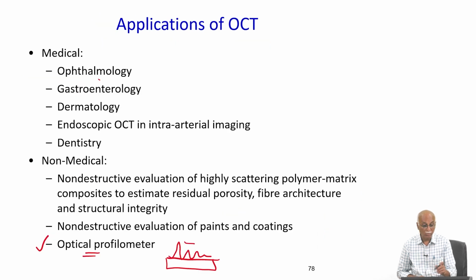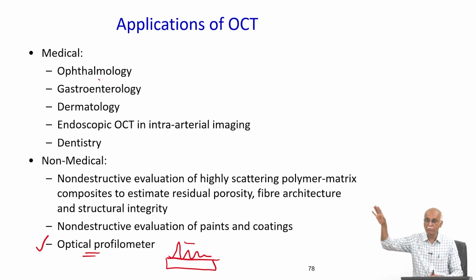It is of course, so different configurations, frequency domain, spectral domain, time domain, but coupled with optical fiber, or coupling it with polarization sensitive approaches, or coupling it with endoscopy. All these different approaches are being worked out or being used for different such applications. Applications, as I told you, it is ophthalmology, it is very much used.